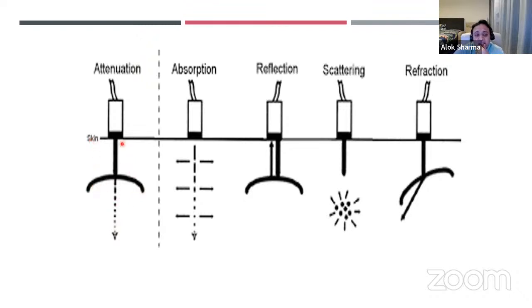So if that's the skin and this is the pleural margin, the pleural margin being superficial, when ultrasound waves hit it, being a flat perpendicular surface, it causes reflection back, and the outermost margin causes a lot of reflection. But actually you have tissue below the pleural margin, and that tissue absorbs those sound waves. And clearly, when you have that, you have what we call reverberations.